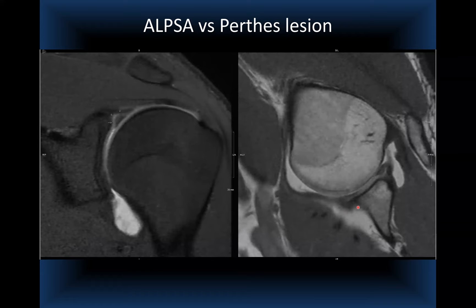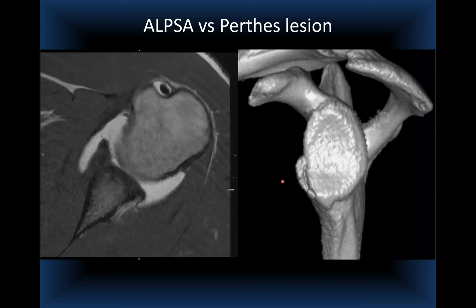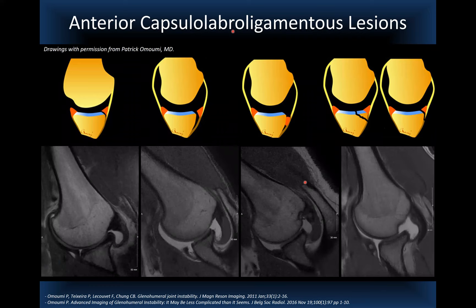CT confirms the stripped periosteal sleeve and 3D reconstruction demonstrates the findings. To summarize the spectrum: Perthes lesions are non-displaced and subtle; acute ALPSA has slightly more displacement; chronic ALPSA is bulbous and scarred down anteromedially; and Bankart lesions — soft tissue or bony — show complete periosteal disruption and detachment from the glenoid ring.